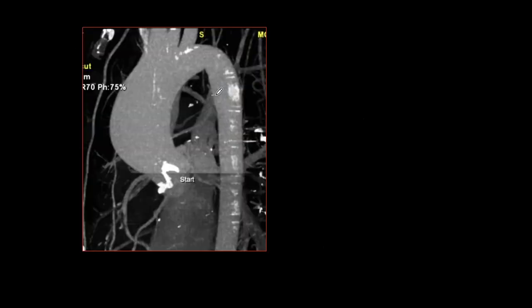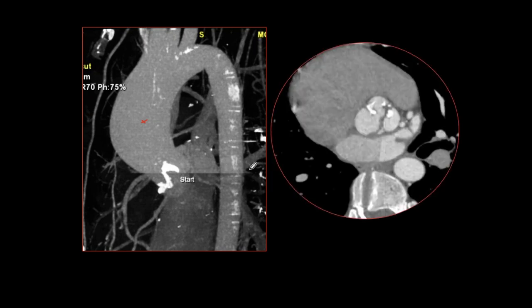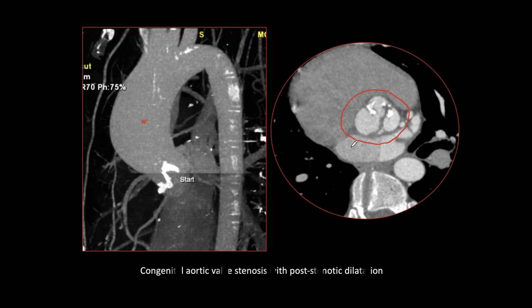We see a reconstruction of an enhanced CT showing dilatation of the ascending aorta, confirming what we see in the plain film, and heavy calcification in the aortic valve. In axial view, we see a malformed and calcified aortic valve. The final diagnosis is congenital aortic valve stenosis with post-stenotic dilatation.